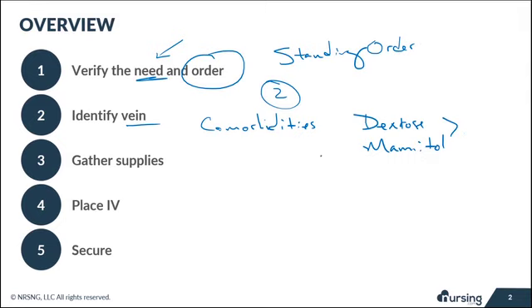And so if you tried to think about putting an IV in the hand, you're probably going to blow it. So what you want to do is think about what kind of therapy they might need. If they're going to be receiving a lot of fluids or medications or what have you through those IVs, then your ideal vein selection is going to change. Maybe the hand isn't the greatest spot. Maybe we need to modify that and go in the AC, or maybe it's in the forearm. We need to find a better location.